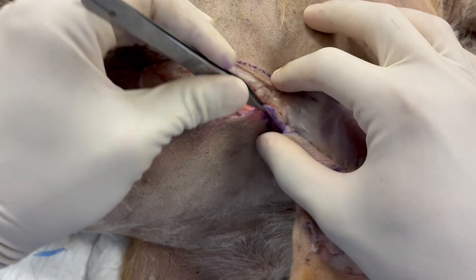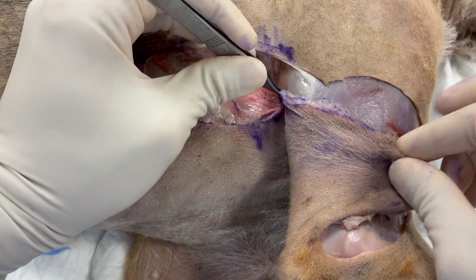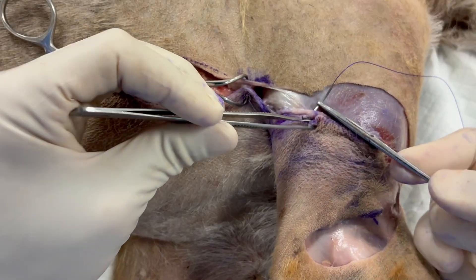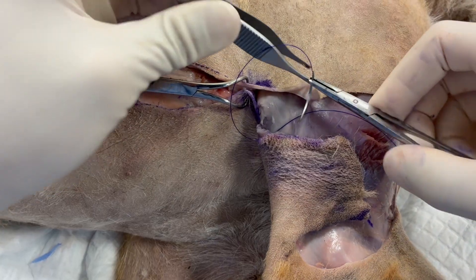Now we know if we've planned this properly we should be able to close the donor site without excessive tension. There is just a little bit of tension at the cranial aspect of the donor site but not excessive, and I'm just bringing that together with a towel clamp.